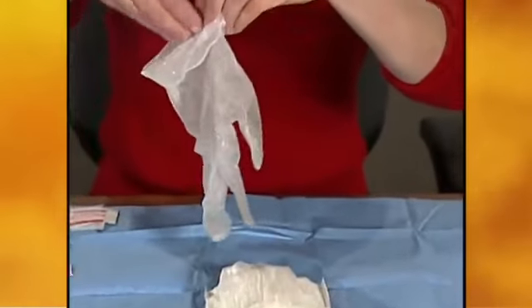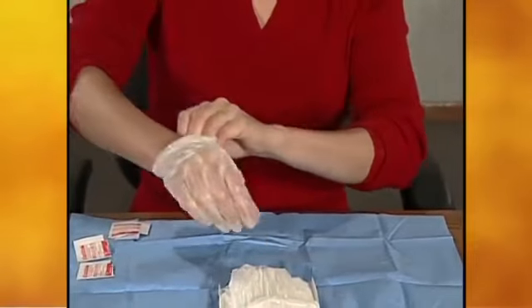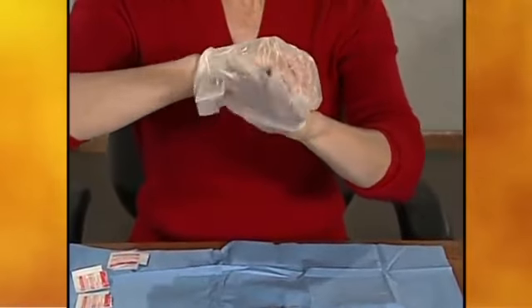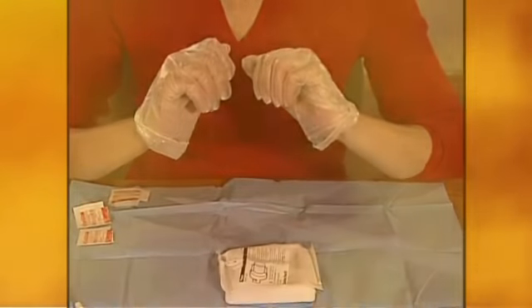Pick up a glove by the wrist and pull it on. Put on the second glove, again holding it by the wrist. Both gloves fit either hand. Remind your patients to keep gloves away from non-sterile items such as skin and clothing.